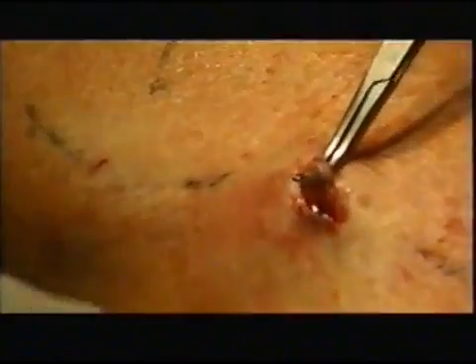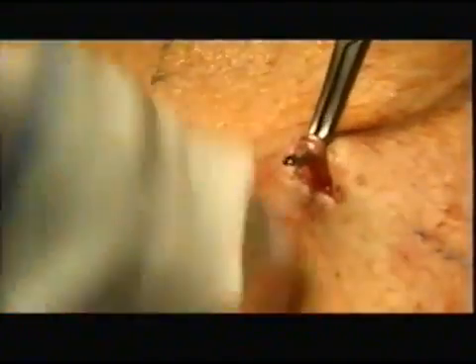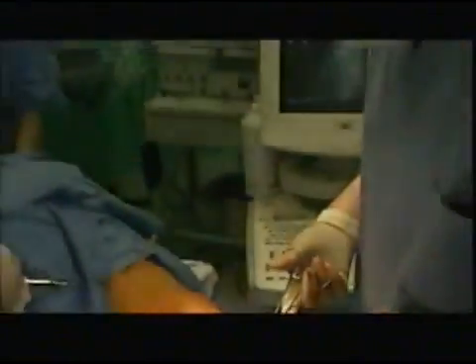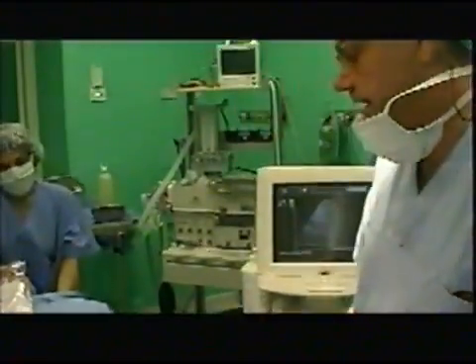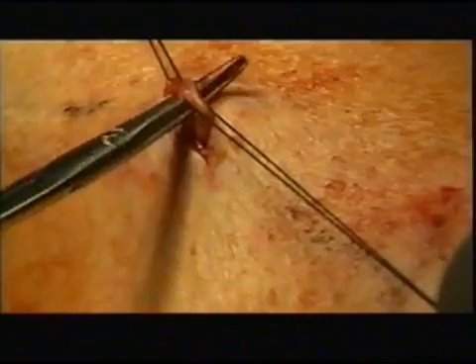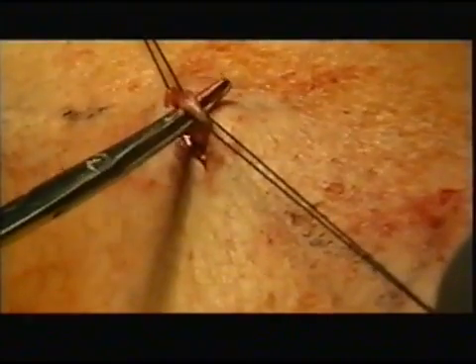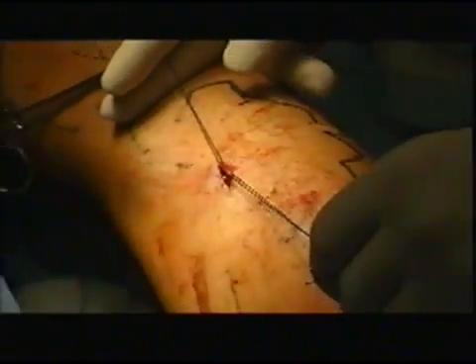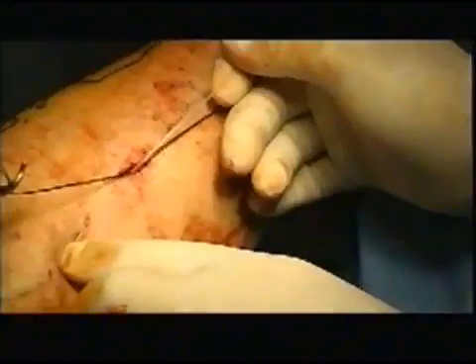In this case, the vein wall is exposed and cut through. Phlebotomy gives access to the fiber optic, which is pushed upward to the apex of the incompetent tract, choosing with the ecocolor doppler the right start point for emitting laser light.